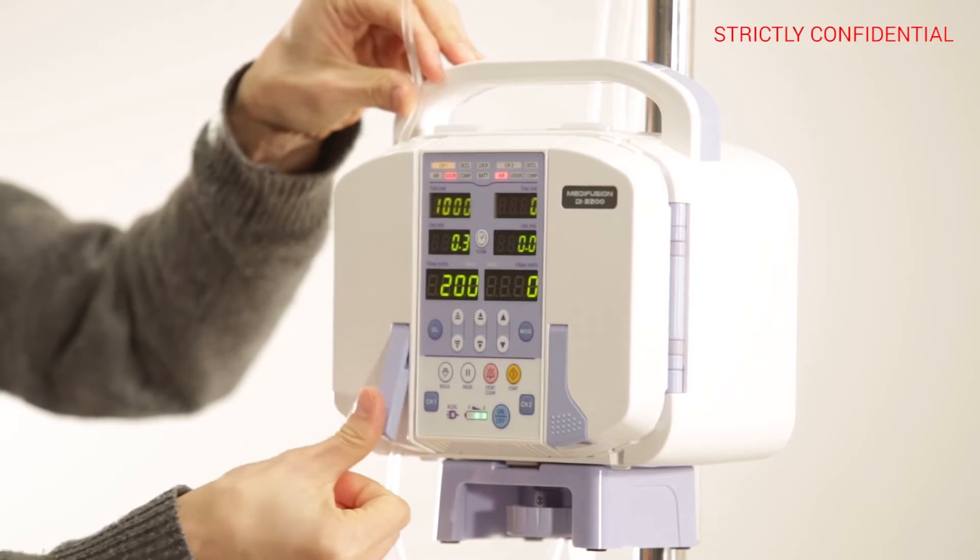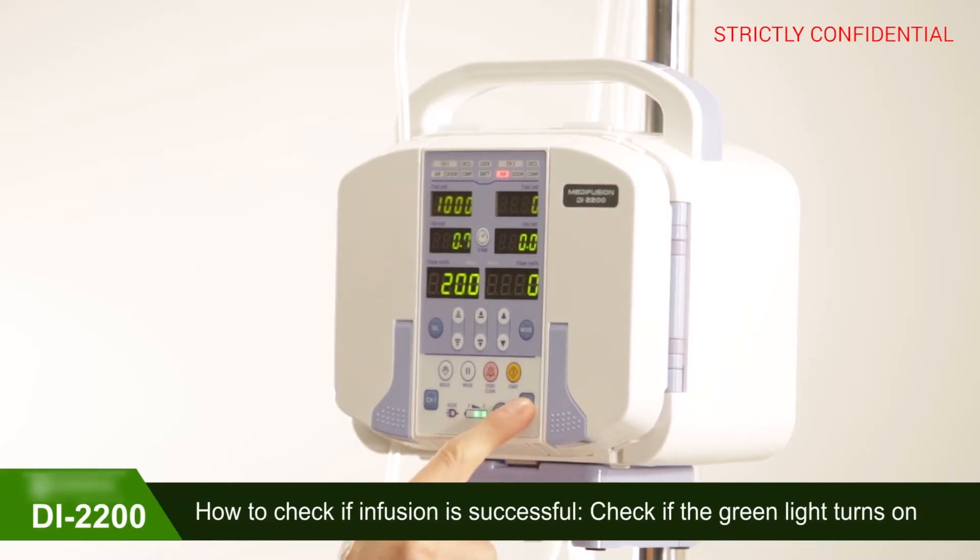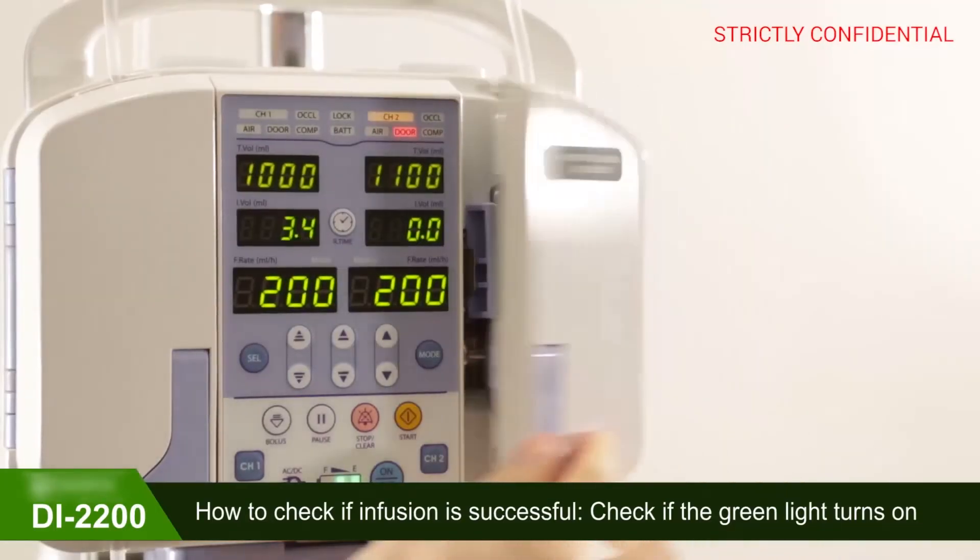Close the door and open the clamp. Use the START button to start infusion. Activate CHANNEL 2 and follow the same process for CHANNEL 2.